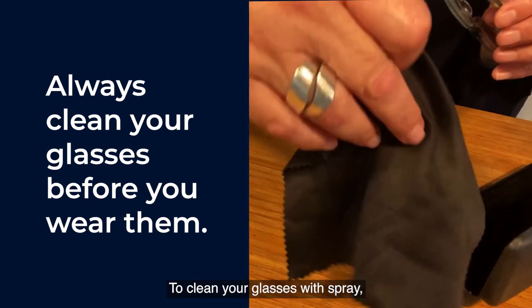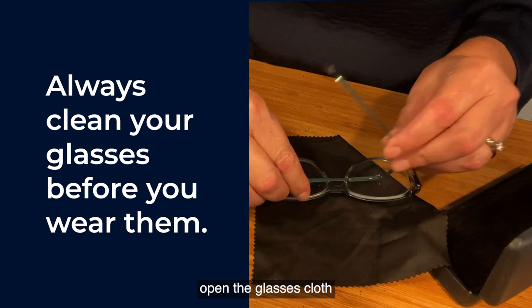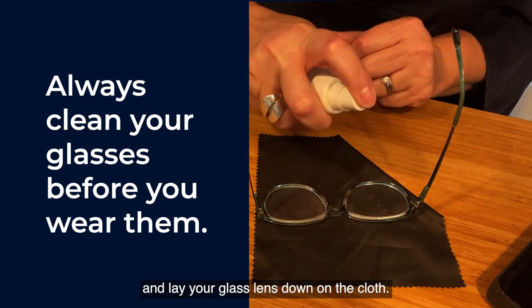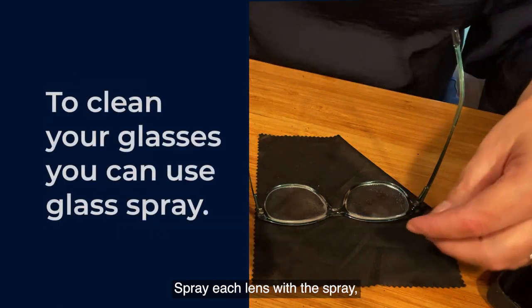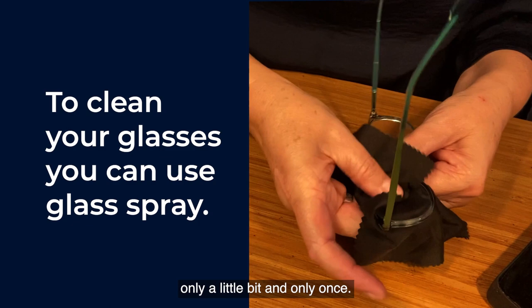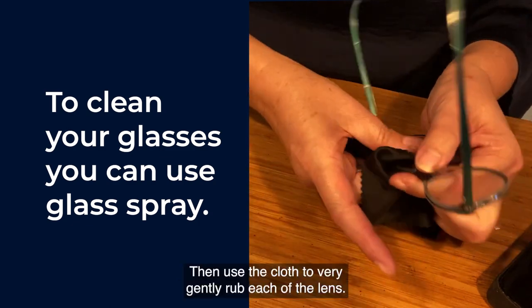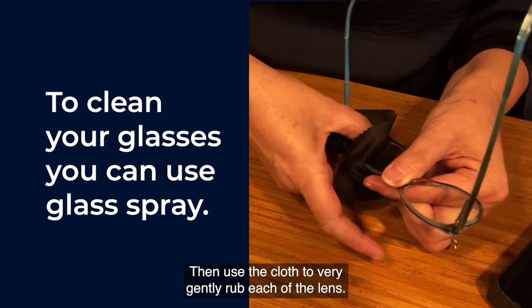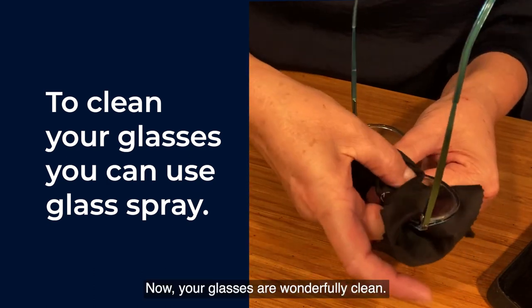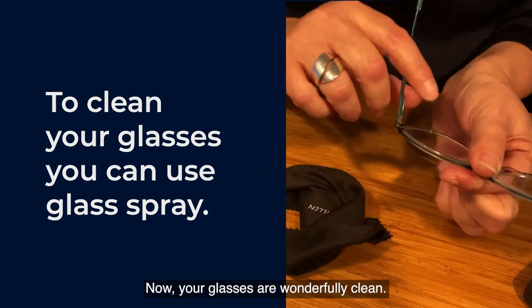To clean your glasses with spray, open the glasses cloth and lay your glass lens down on the cloth. Spray each lens with the spray — only a little bit and only once. Then use the cloth to very gently rub each of the lenses. Do both lenses. Now your glasses are wonderfully clean.